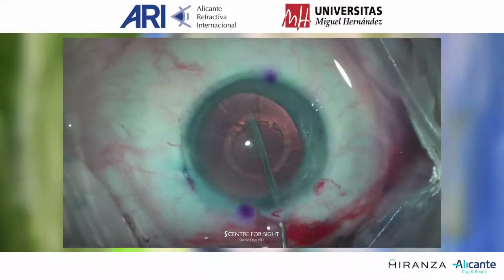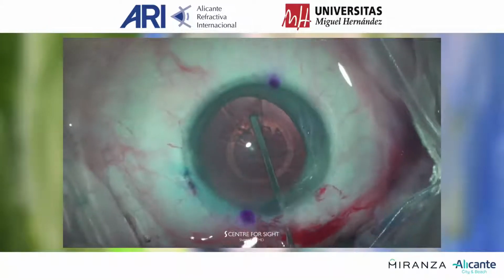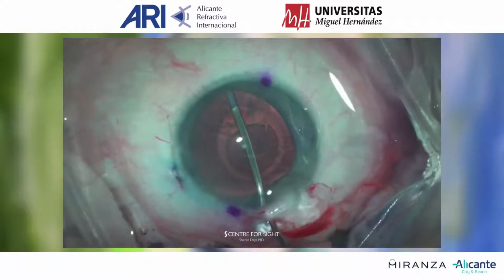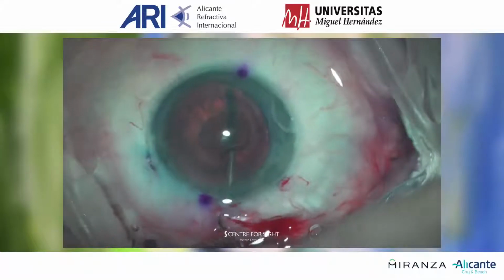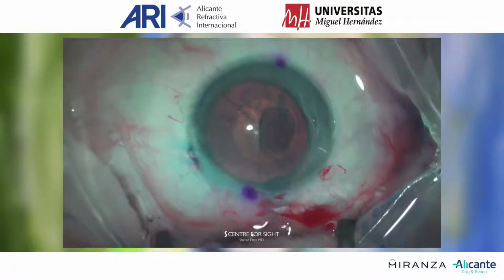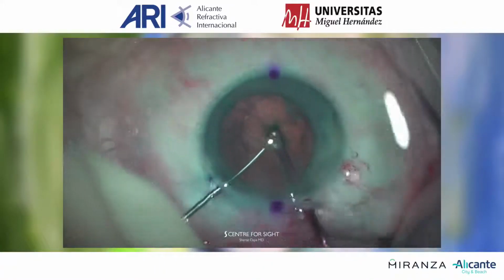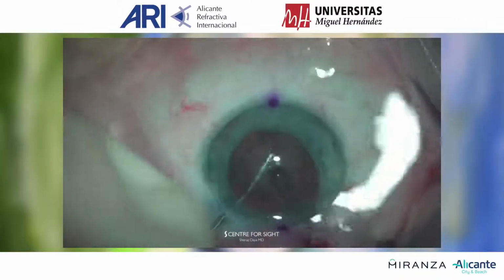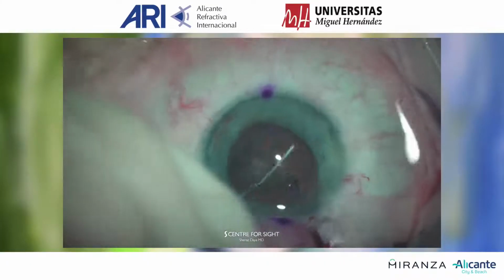Here I'm just doing a cortical cleavage hydrodissection, lifting up the anterior capsule, and then ensuring the lens is loose. Standard phacoemulsification takes place, and the lens is fairly soft and easy enough to remove.